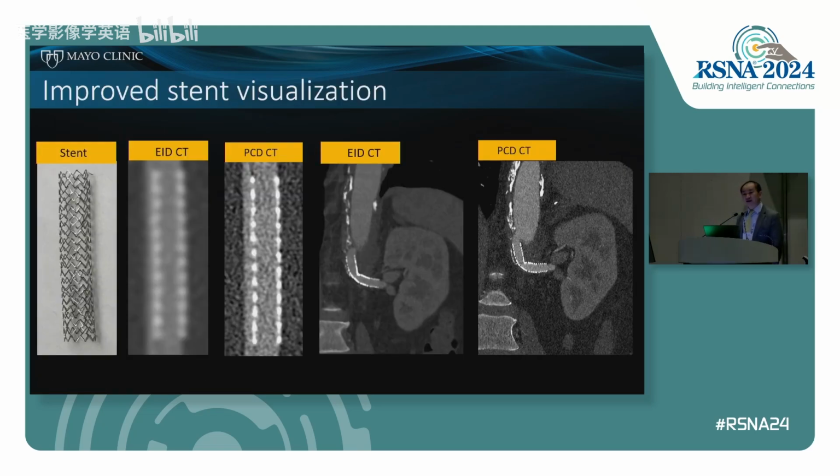Coronary stent, and about some other stents, with the high resolution we can see the individual struts of the stent much nicer with photon counting, and on the EID you basically see a big block of metal there. And not only the metal itself, inside the lumen we see them better, because with the limited resolution we have so-called blooming artifact that affects how we look at the lumen.